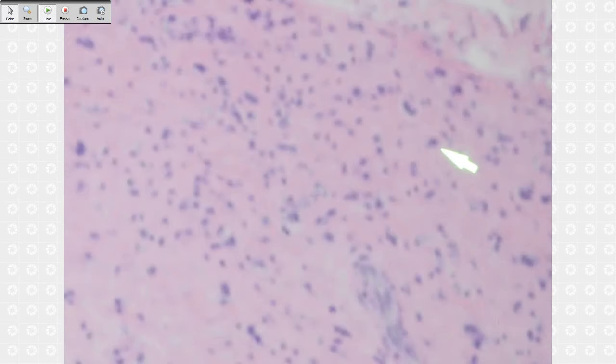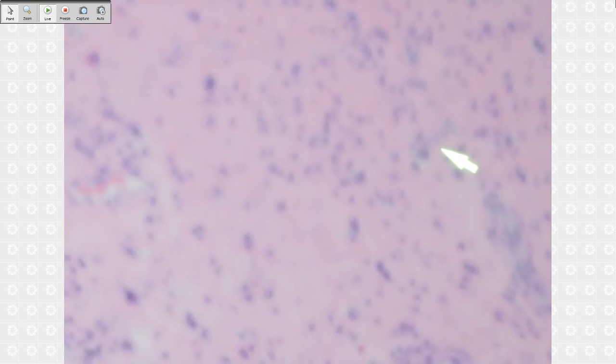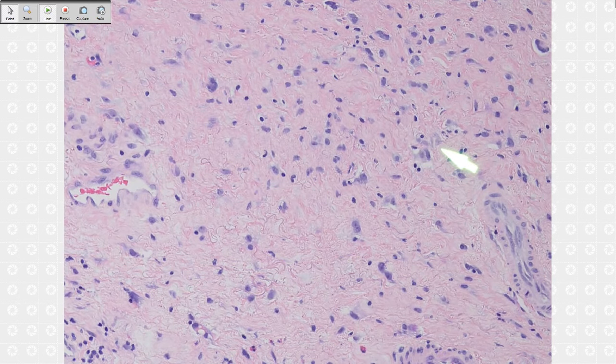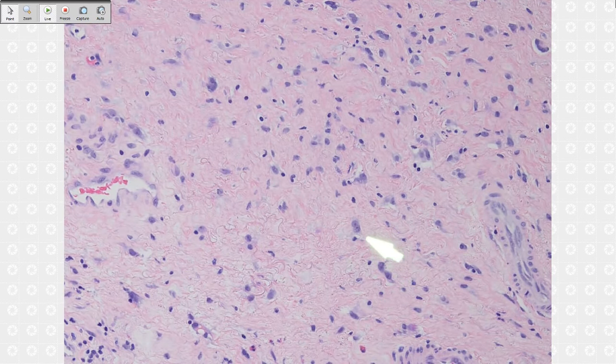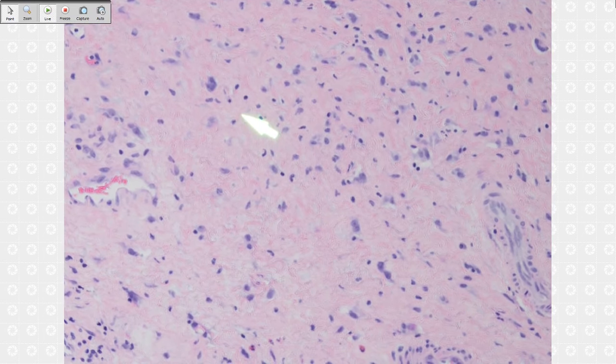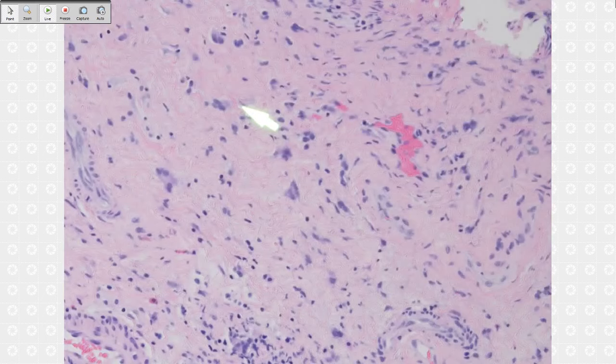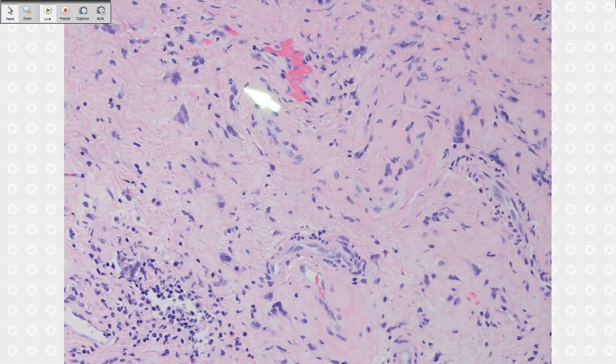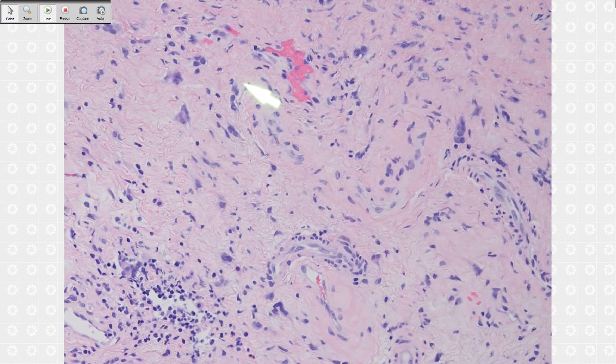Some single cells in the stroma are really big and ugly, and some have prominent nucleoli, right? Are you worried about those cells? Yes, like prostate cancer. Gleason 5+4, the 5 is like single cells, so I said I need immunostaining. Dr. Haynes said, what else do you need to think about? I didn't think about the others. He also mentioned this may be a cellular fibroblastic reaction in the stroma. Okay, but we still do the immuno.